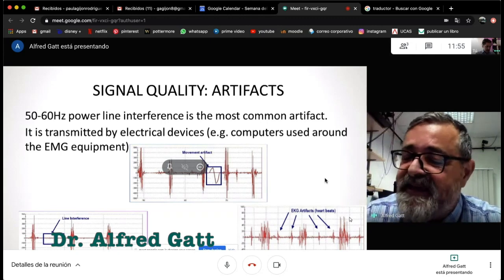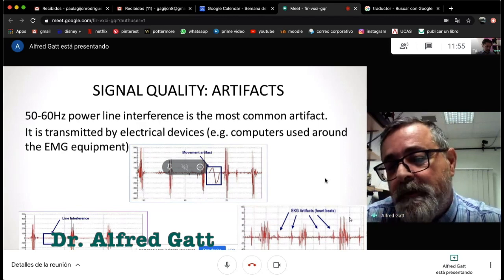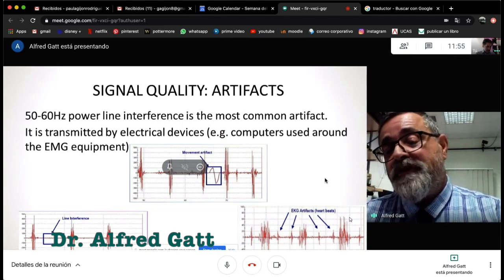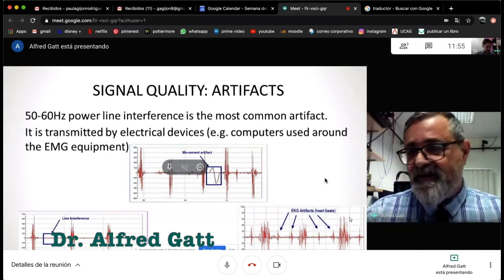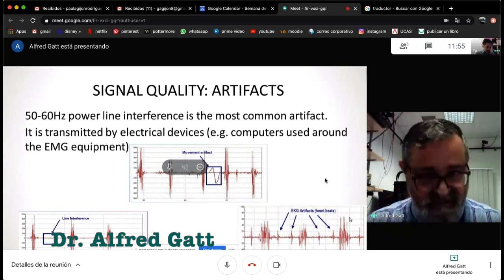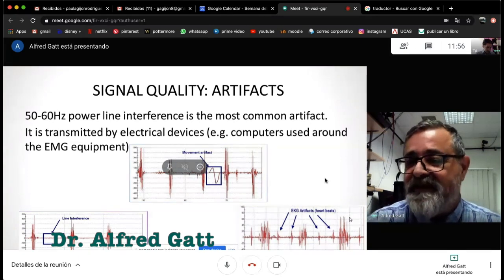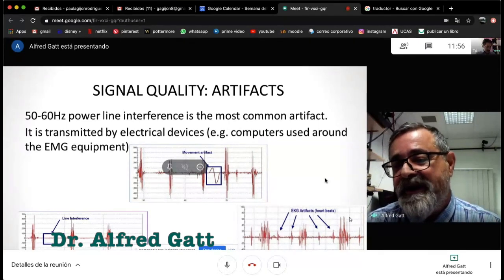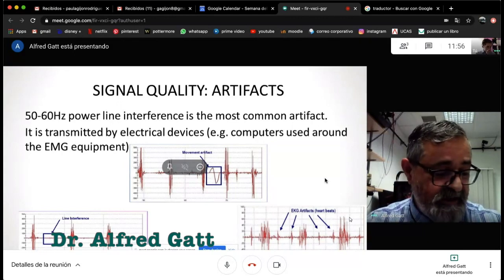So obviously what I'm saying here is that we need a lot of preparation in order to obtain a good signal and in order to clean, filter, and then interpret the signal. So it's not something that can be done by everyone, where you just get an EMG and just start using it. Our students, for example, those studying for a master's in clinical biomechanics, all go through training on how to do EMG or how to do research with EMG and so forth.